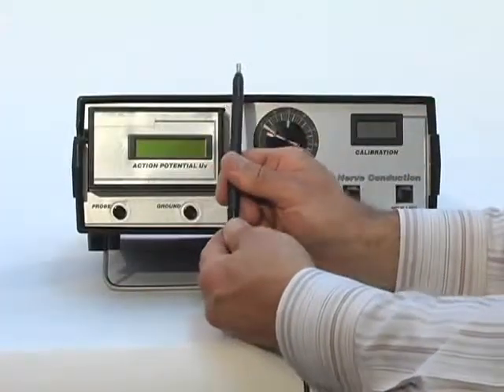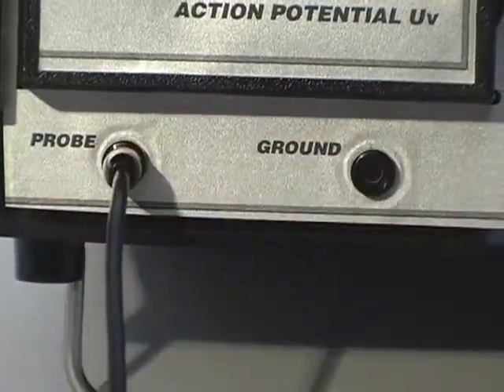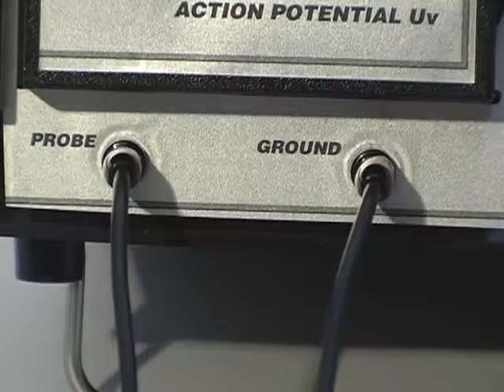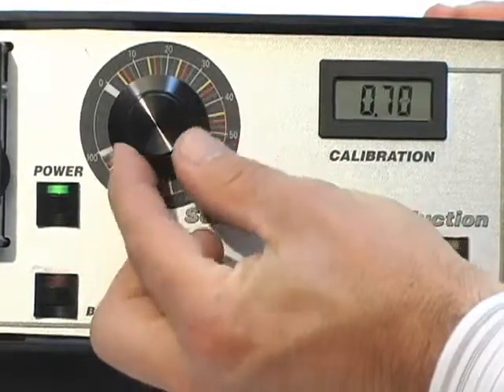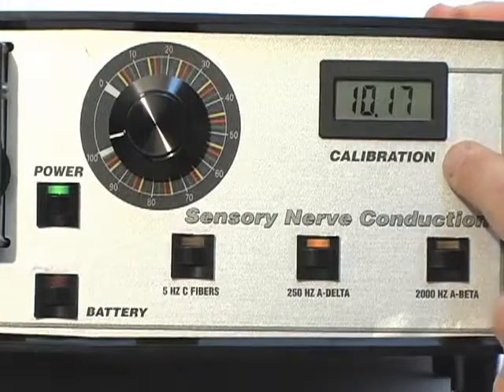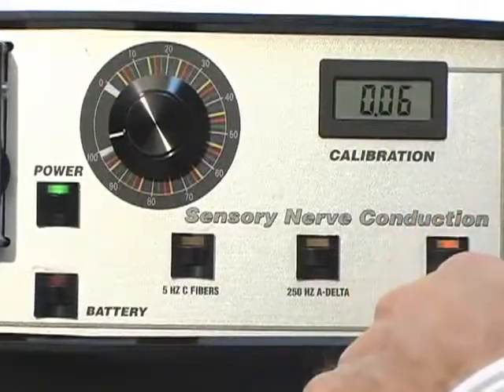Test the other cable. Pull the black cap where the cable connects to the end of the probe. Plug each end of this cable into the probe and ground ports as done before with the other cable. Turn the power on and set the device to 250 Hz. Turn the dial to 100 and check the LCD. Now flex the cable watching the LCD. The problem is in this cable.